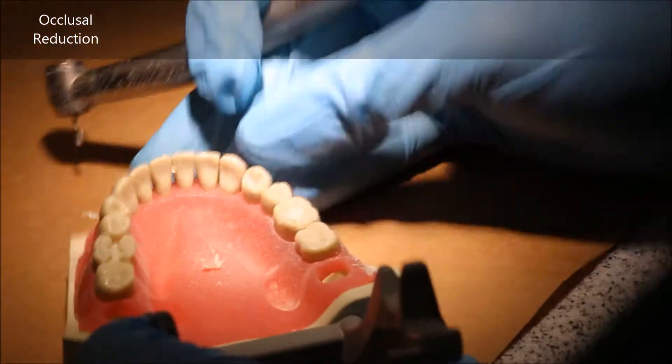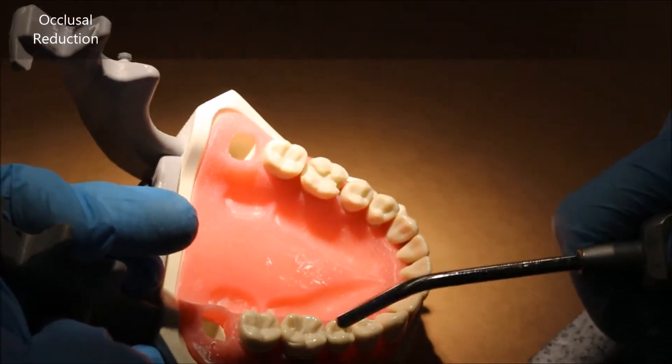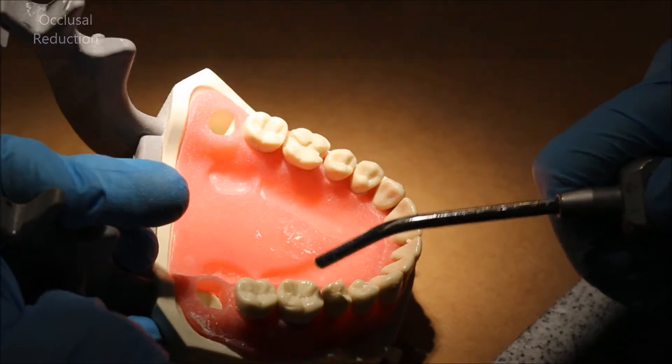The burr that we use for this is the 57 carbide. It's a straight carbide burr that is one millimeter in diameter. So by the time you make your depth cuts, you should have a one millimeter reduction wherever you made your depth cuts.